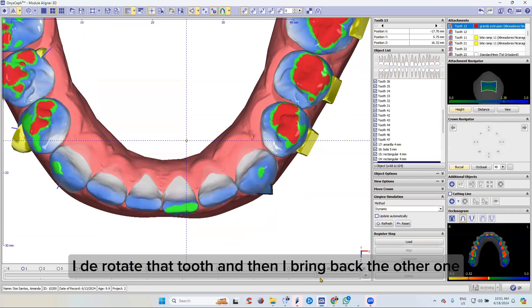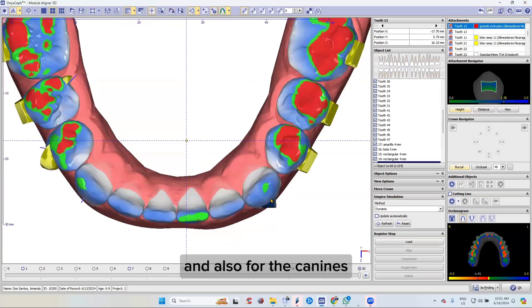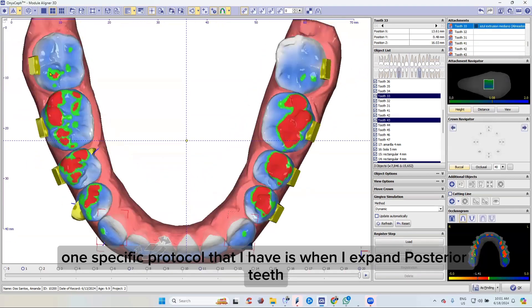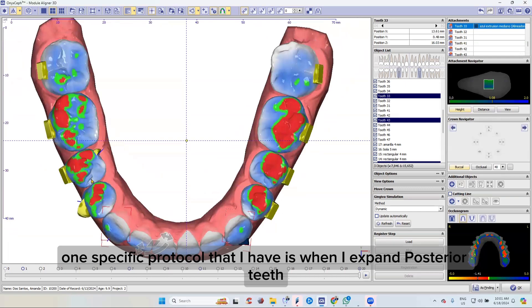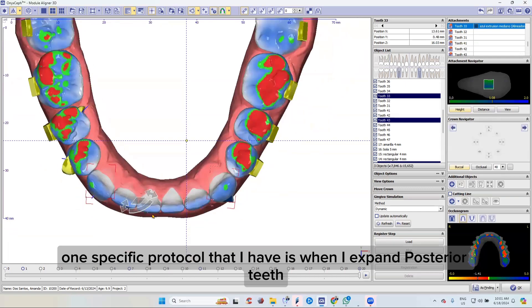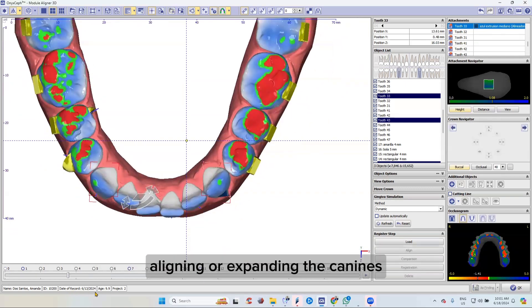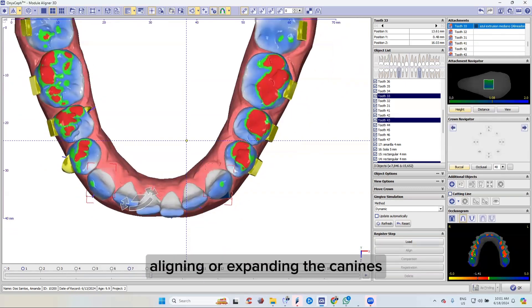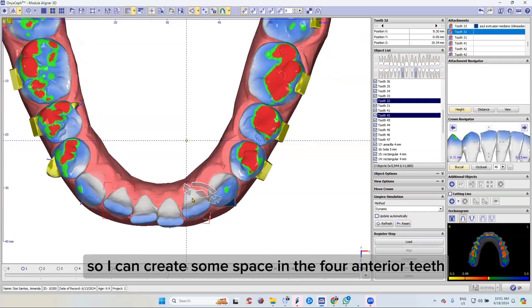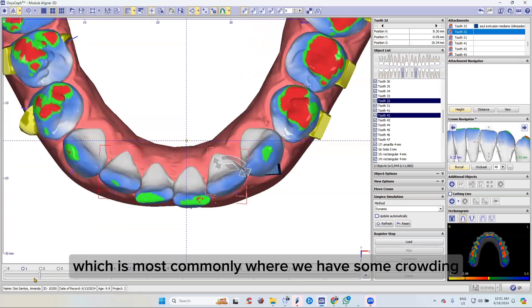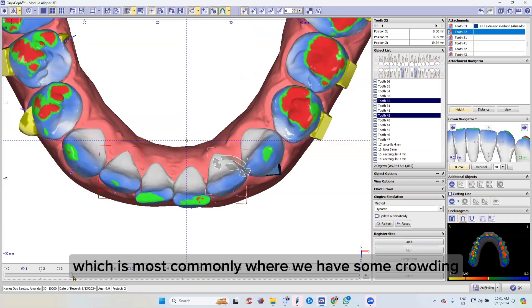I derotate that tooth and then I bring back the other one. For the canines, one specific protocol that I have is when I expand posterior teeth, I always start, if it's possible, aligning or expanding the canine so I can create some space in the four anterior teeth, which is most commonly where we have some crowding.